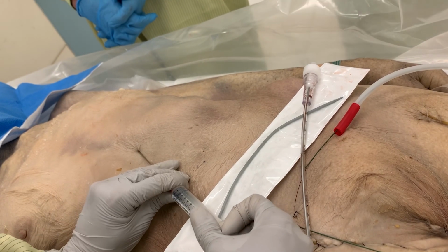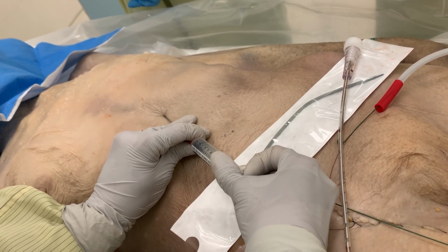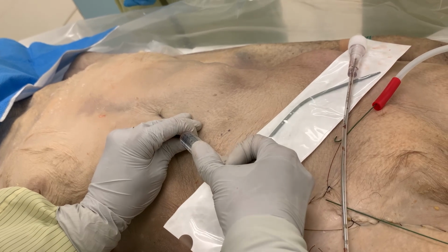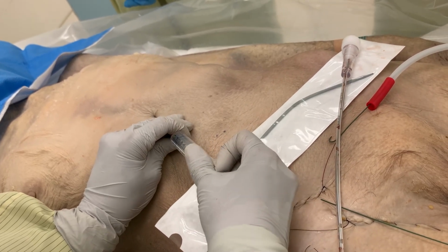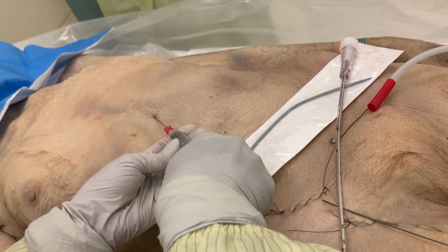If ultrasound is available, confirm the needle is in the pericardial space and not in the heart with an apical 4-chamber view. Secure the needle at the skin to make sure it does not move, and change to a large syringe and continue to remove the fluid.